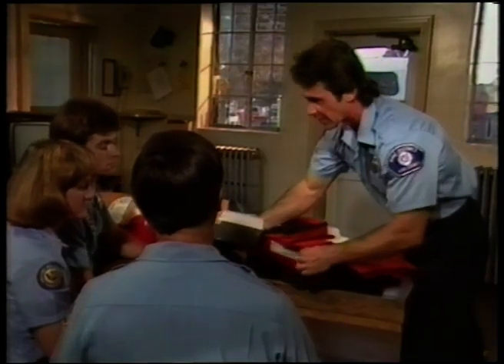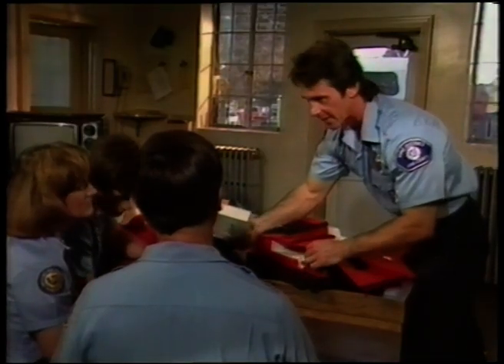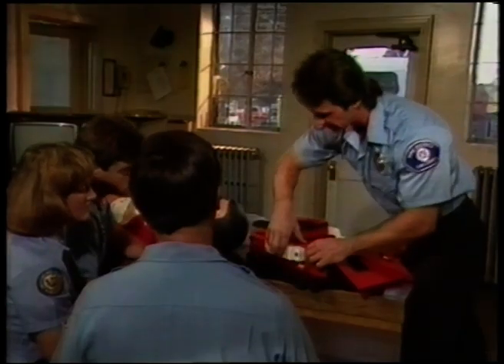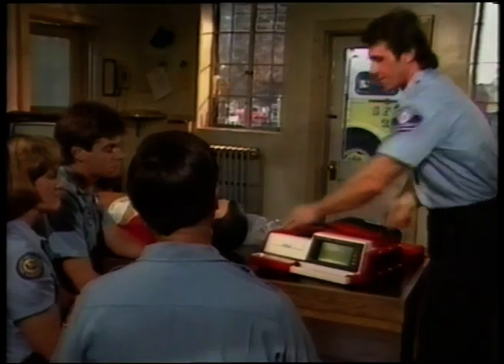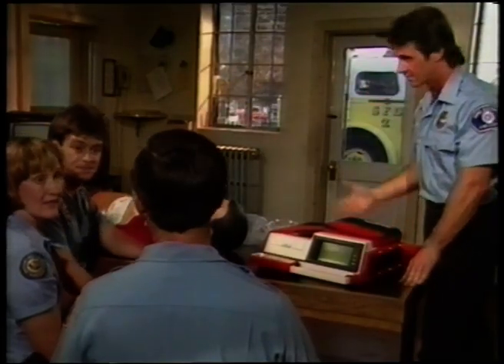The LIFEPAK 300 is a battery-operated device. It will not operate with a depleted battery even if the battery charger is connected. It will not operate off wall current. Always carry a properly maintained, fully charged spare battery.